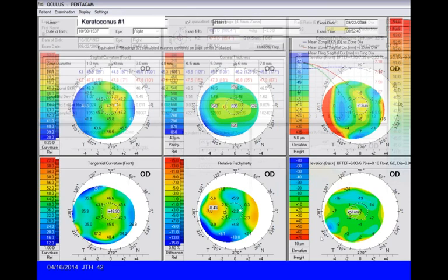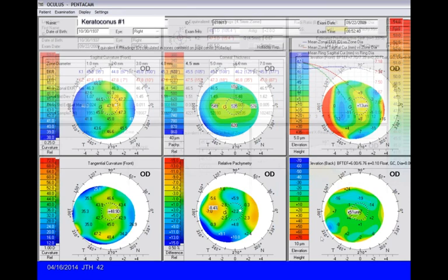Let's look at another keratoconus patient. Here's his peak where the cone is, and here's the peak he's actually looking at. The cone's peak is at 49 diopters—sometimes a topographer or keratometer will give you that 49-diopter value, but that's the wrong value to use. It ends up making the selected IOL power too low and results in a power that's far too high. The EKR-65 is the one that gives you the best result.